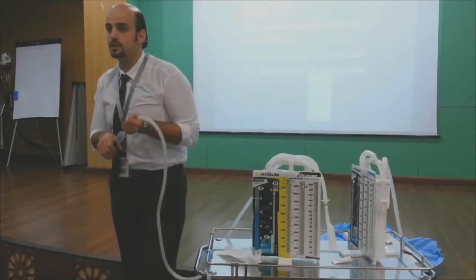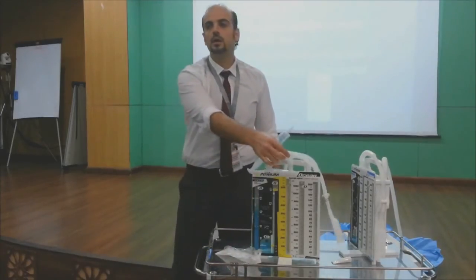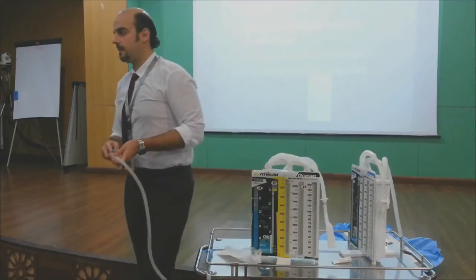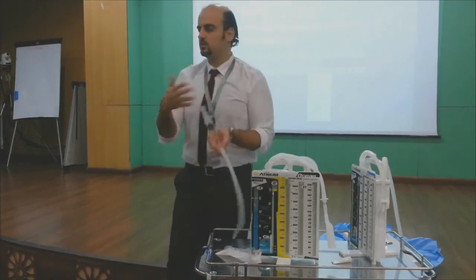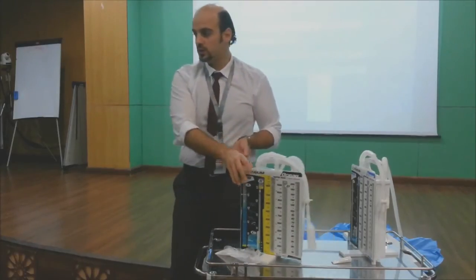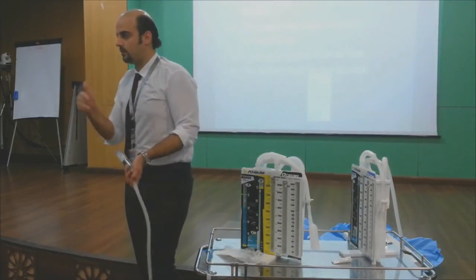Can you see the oscillation? Why am I doing negative suction here on this port? Can I examine oscillation? No, I can't. Because of the negative suction, this new technology here, actually I don't know the mechanism to explain it, but it's only negative suction. It's only sucked from the chest, okay?